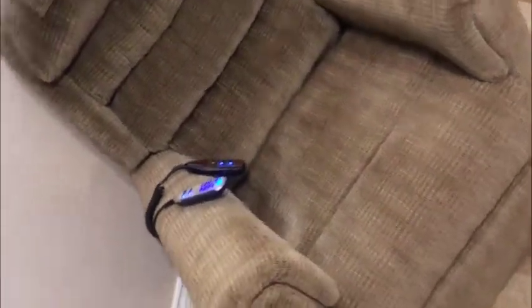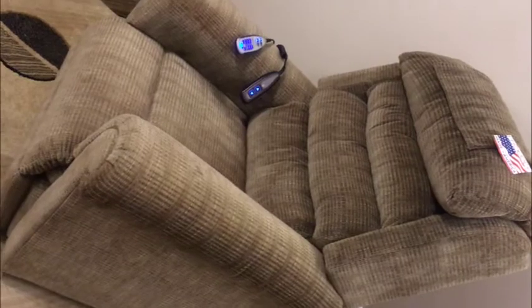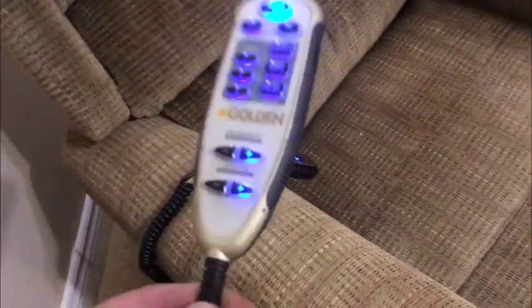This is a 2-motor chair. The majority of chairs you're going to find on Kijiji and Marketplace are single motor. What does that mean? Well, we'll find out soon, but it does give an equation to durability and comfort. And so that's what we're first going to explore. 2 remotes, one for the heating and one for the massage. I'm going to set this aside. We'll do that after.